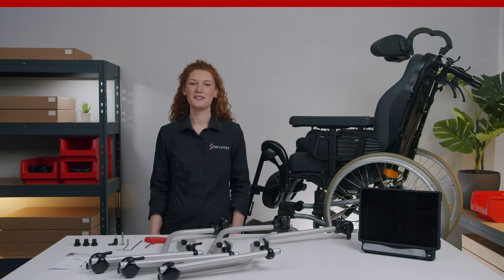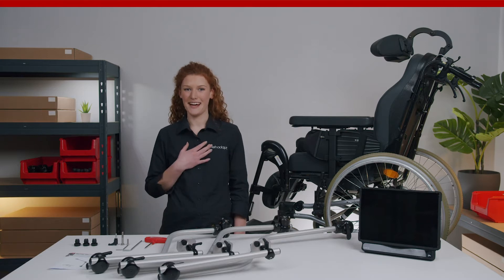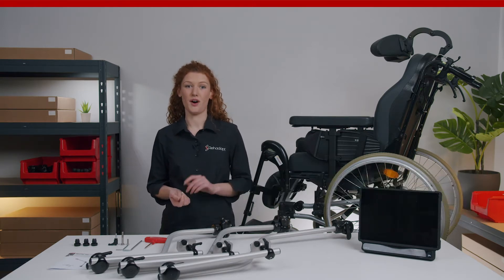Hi guys, welcome to a new episode of Monty Made Easy. I'm Nadine from Rayadapt. In today's episode I want to introduce you to a wheelchair mount idea for eye gaze devices — it is the Monty 3D curved L mount, and I will also show you how to assemble it on a wheelchair.